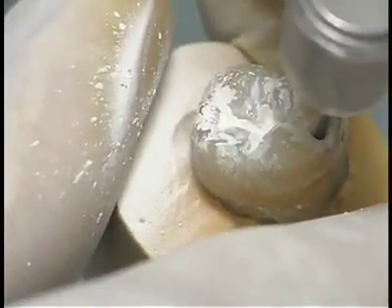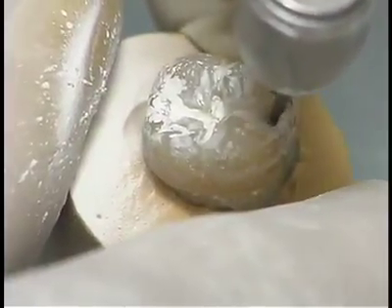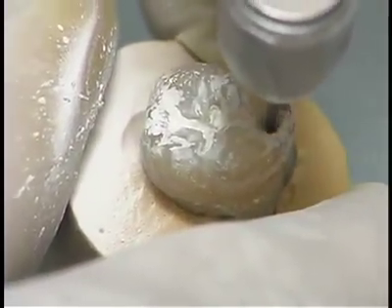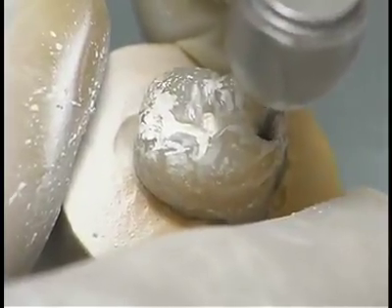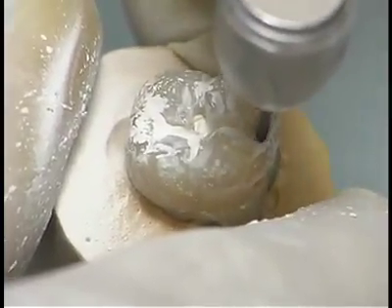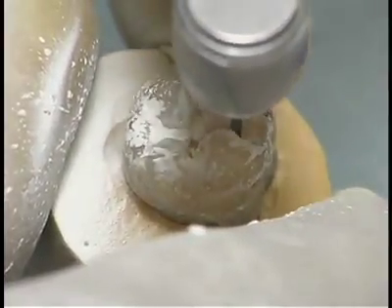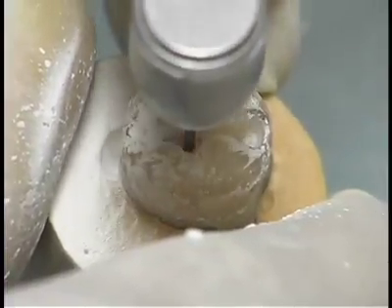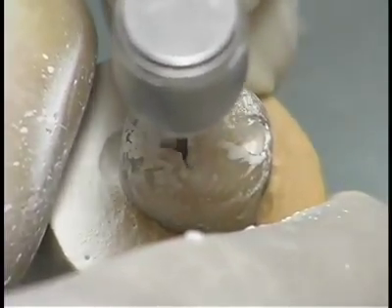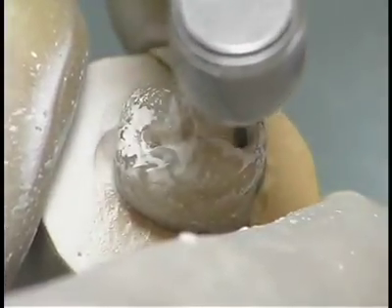The proper depth of 0.5 millimeters into dentin should be established. With intermittent pressure and continuous movement from one point to another following the DEJ, continue to maintain the burr's orientation and depth. Ideally, the width of the isthmus should be just wider than the diameter of the burr. The orientation of the burr should change to satisfy the direction of the different occlusal walls of the cavity.